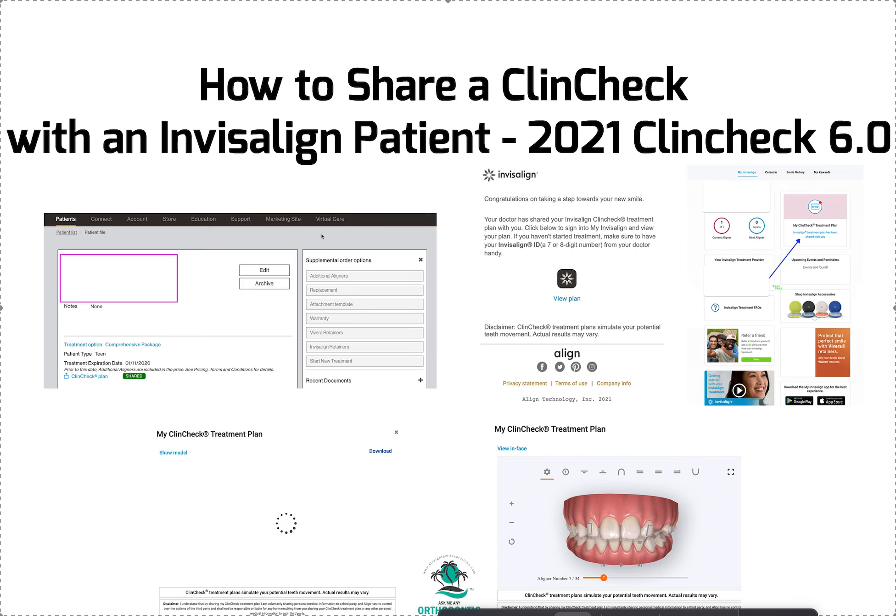So you guys should learn how to do this. I've been both the doctor and the patient — meaning my daughter was the patient. I've gone through it recently, so I'm going to take you through the steps. It's a little bit clunky; it is not easy.